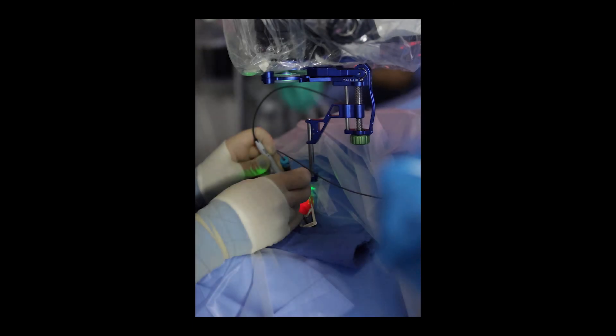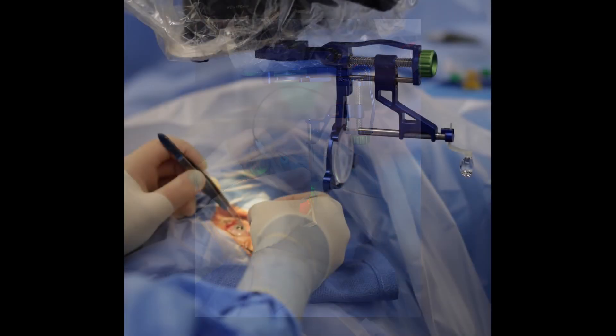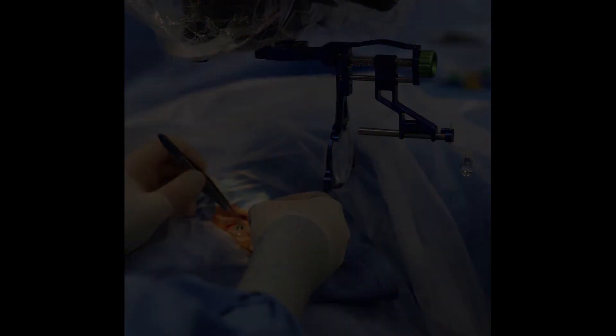This is a great unit if you're looking to start up in a new surgery center. Just having good competition in this marketplace is essential — when you have Android competing with iPhone, it makes both sides do better things, and that's going to ratchet up what we as retina surgeons are able to get for the cost. I think the HALO fills a lot of needs. If you're looking to get into doing retina in your surgery center, or if you need a replacement unit, a backup unit, or you're looking to use a second room, consider the HALO because it's going to drastically reduce your cost and add to your flexibility. It's a great product.